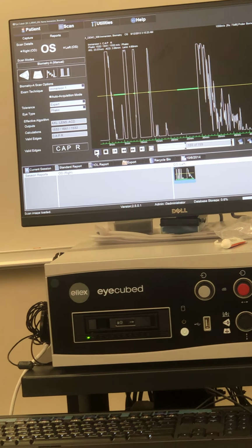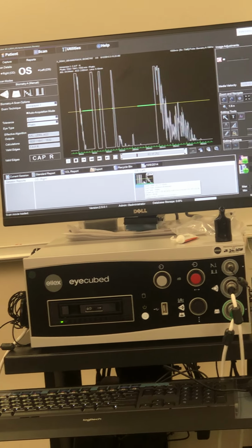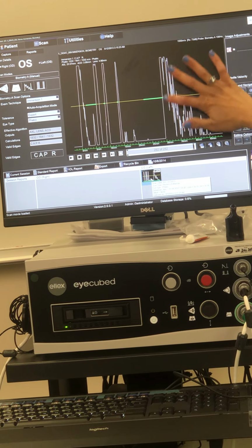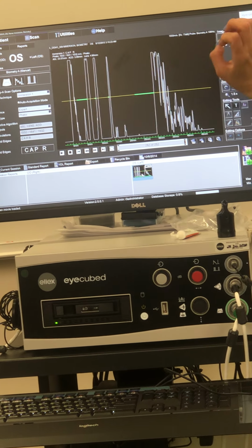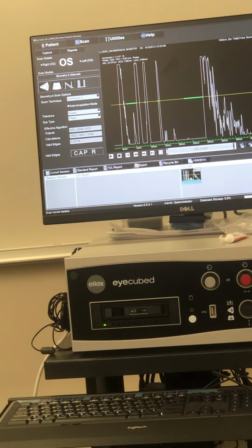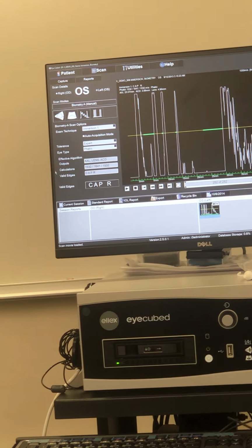You can see here, play this. As you play this movie, you'll see these are all capitalized. If there wasn't a valid edge, meaning a spike is missing, this is going to be lowercase, which means that you haven't captured that valid edge.